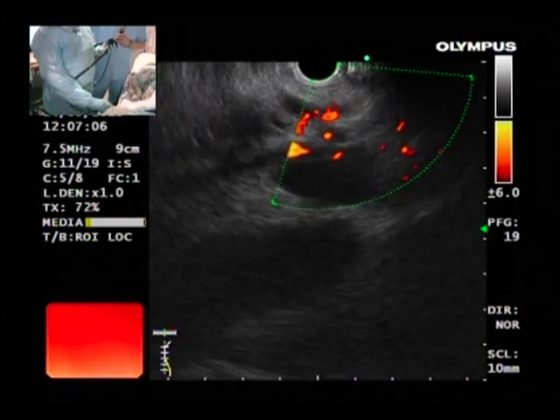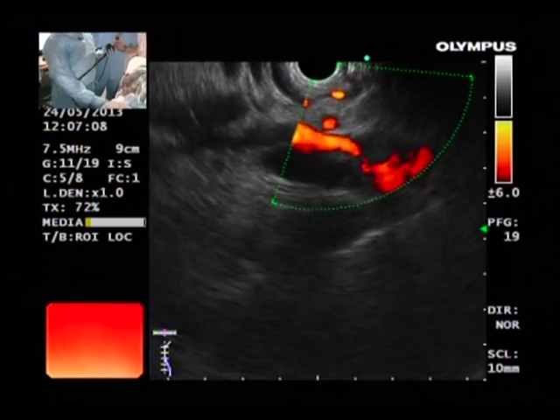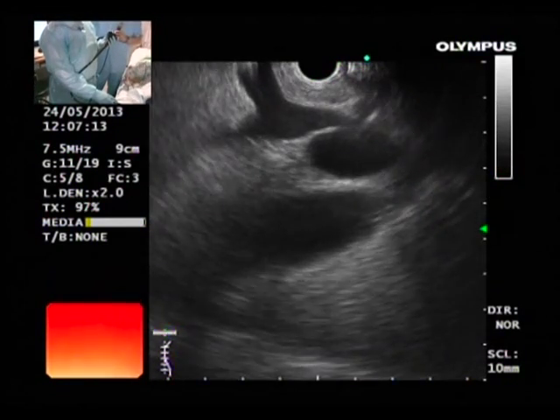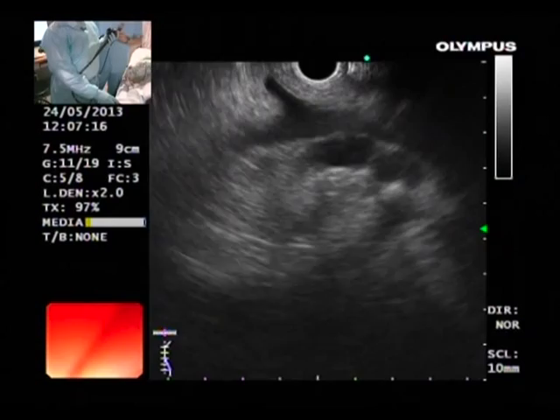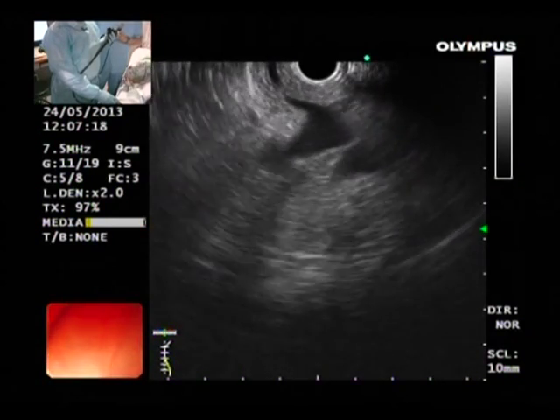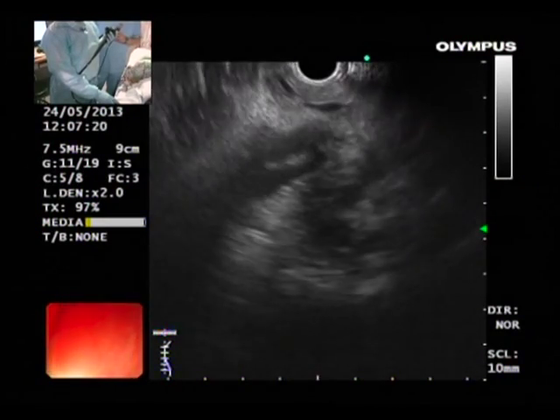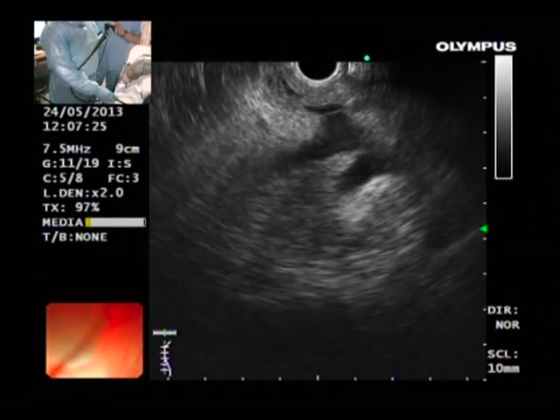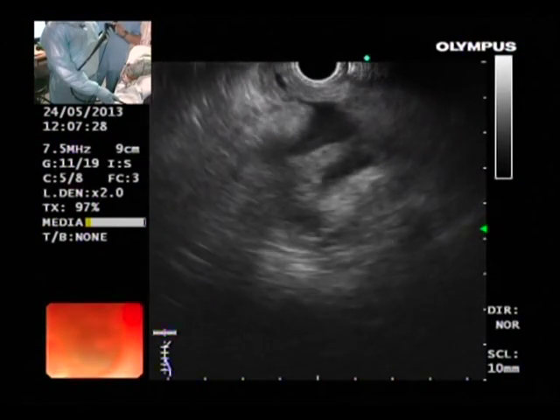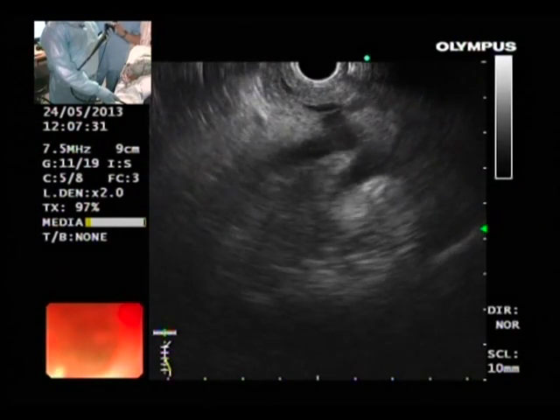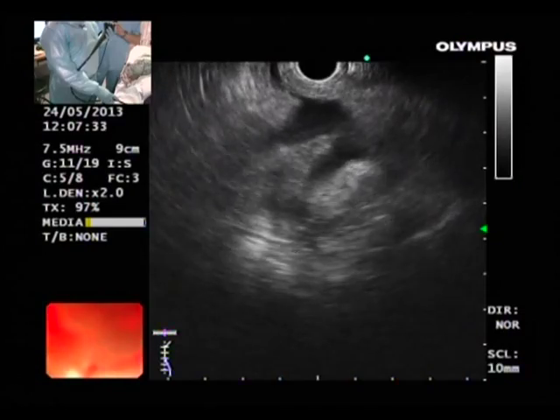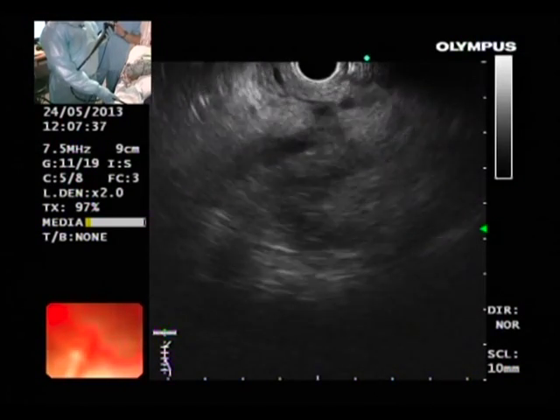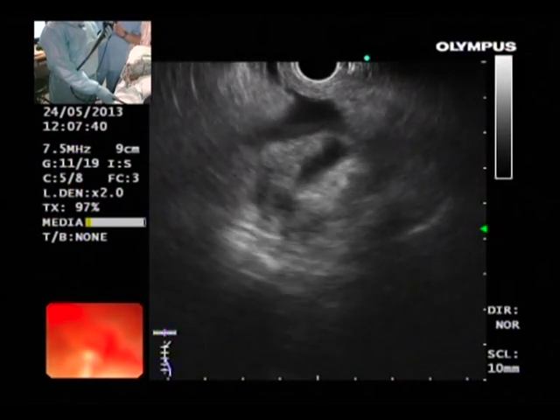Now if I follow the CBD going gently forward — here you can see there is a stricture. See this? The CBD becomes narrow here. You can see the stricture? And you can see that the SMV — the superior mesenteric vein — is above it. So this is the bile duct stricture in the head of the pancreas, with the SMV above it.